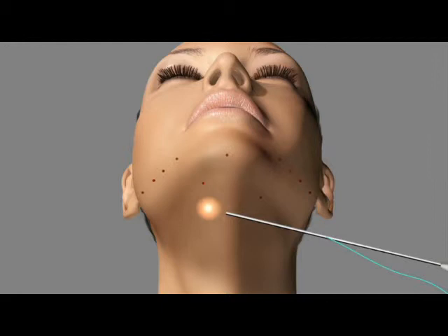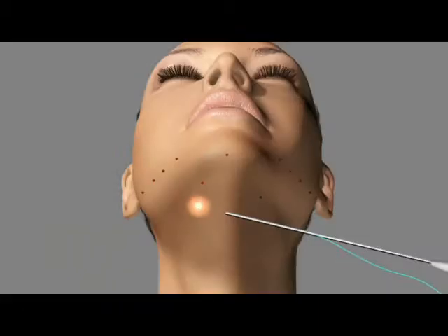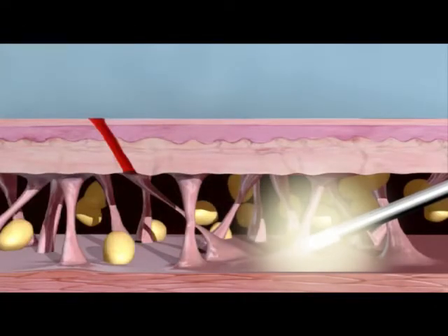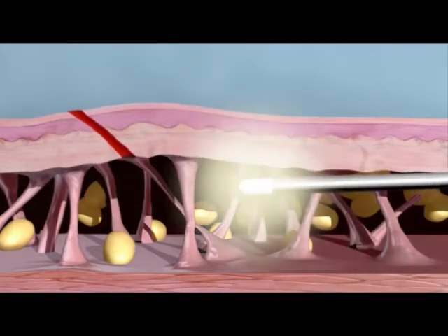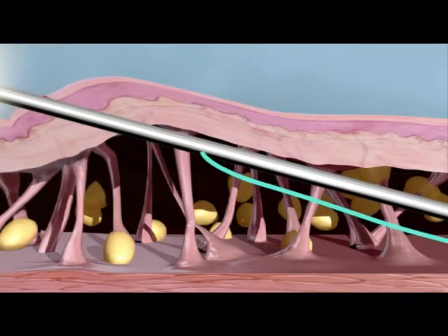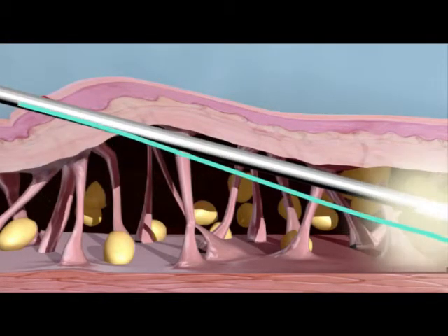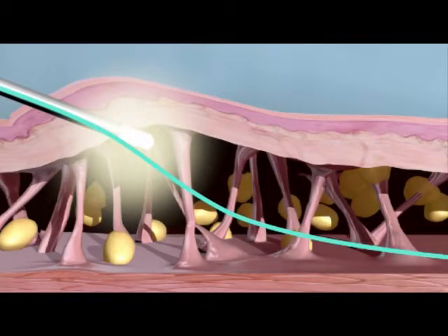The suture rod is then passed in the subcutaneous plane. If it passes too deeply, a dull red light will be seen transilluminating. This means the rod needs to be backed up and re-advanced more superficially. If the rod passes too deep, the muscle may be penetrated and the patient may have early, recurrent, or residual platysmal banding and less than ideal results.